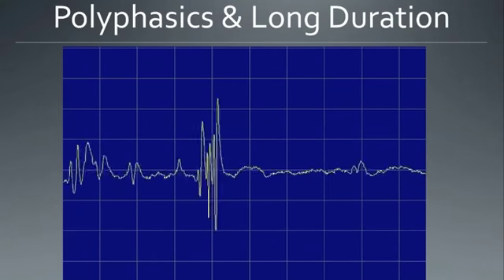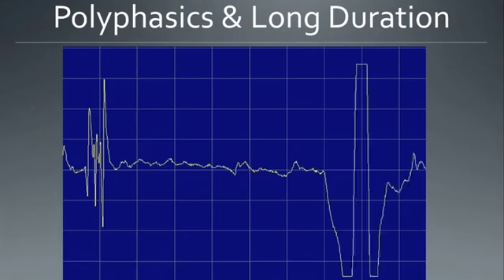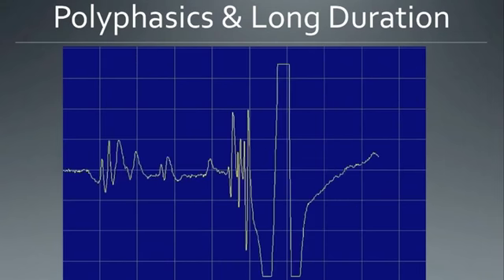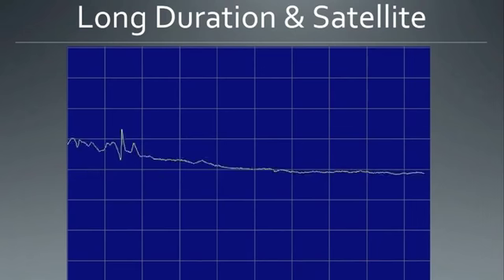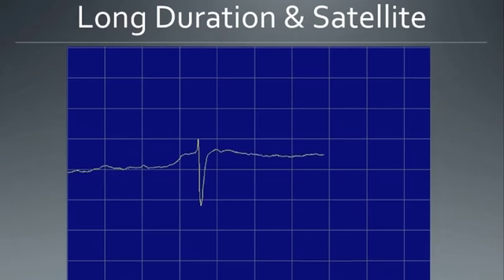In chronic denervation, when the muscle has lost its nerve supply and then got reinnervated, you see these polyphasic units. The unit has many phases, and occasionally you have these big large units as well. This is chronic denervation and reinnervation, and is seen when the lesion has been there for at least 4 to 6 months. When the lesion has been there for far longer, years, you will see a long duration unit, occasionally with satellite potentials, and these are seen in very chronic, long-standing denervation.